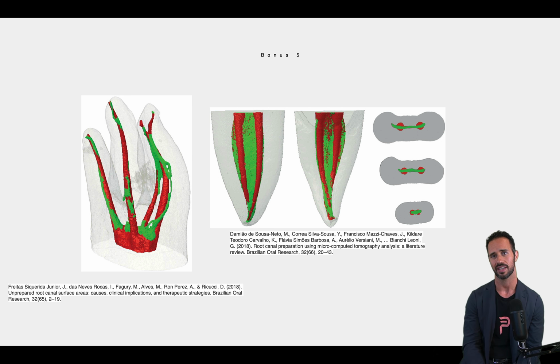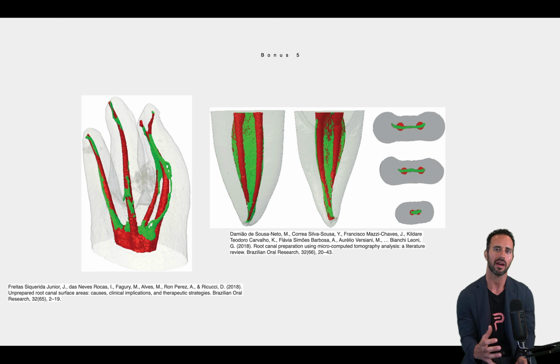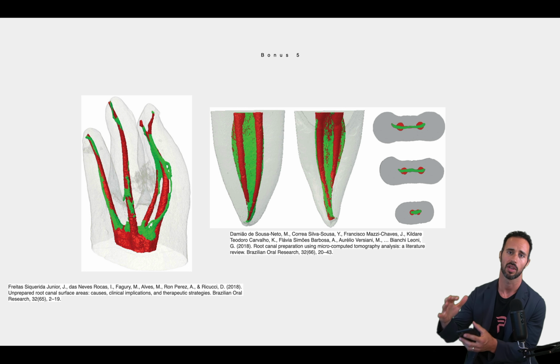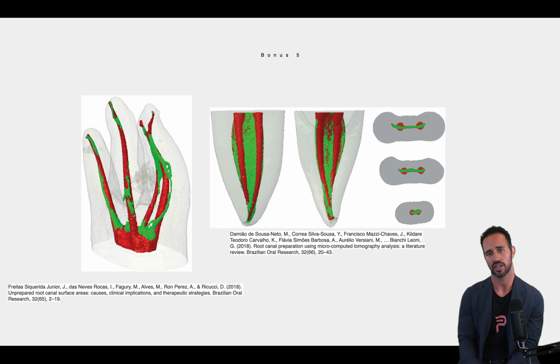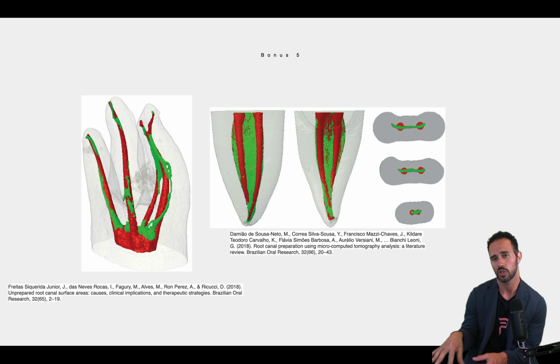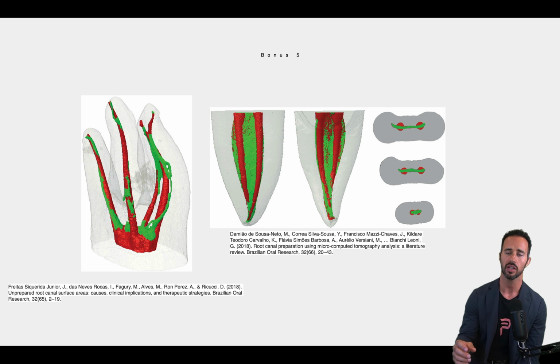But if you're instrumenting the case in 20 seconds and only spending another 20 seconds on your disinfection, how do you compare the amount of time that the sodium hypochlorite has had a chance to soak in that tooth versus the old-fashioned 3-hour, multiple-visit root canal treatments, where, yes, you're less time efficient with your instrumentation, but the sodium hypochlorite in the meantime has had hours to soak? So if you're going to do a speedy instrumentation, you've got to really take your time and do your due diligence with your disinfection. All right, so keep that in mind.